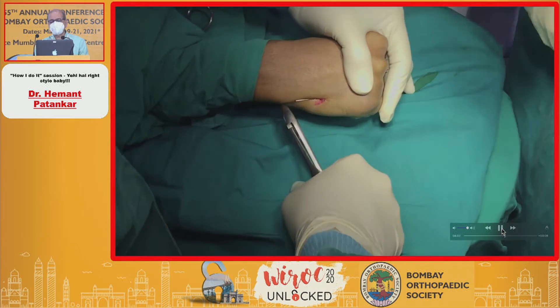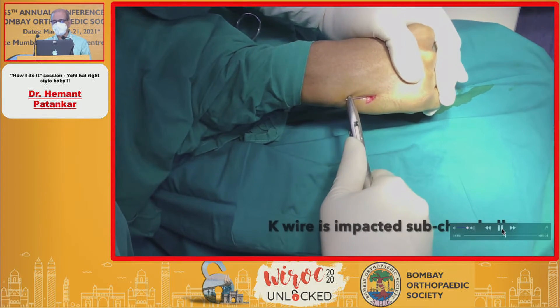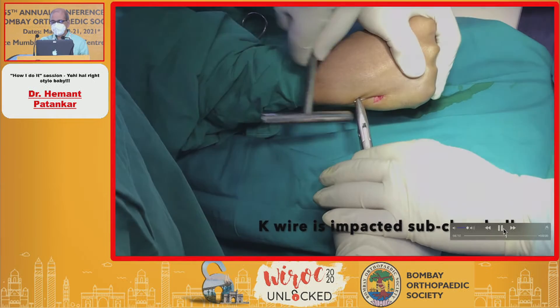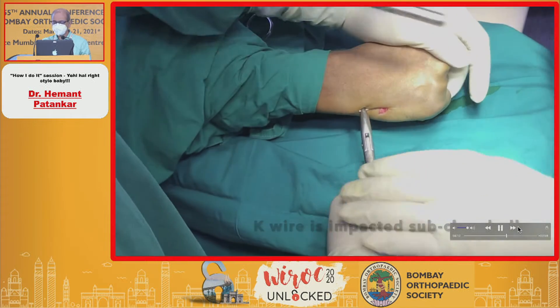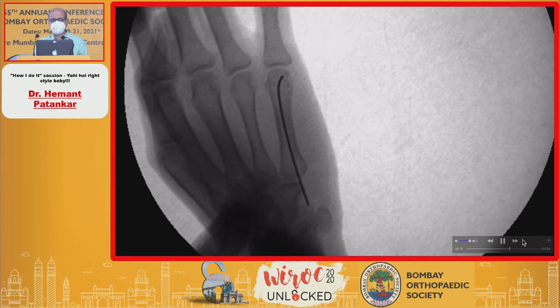That is the wire which is now cut. It is now very less likely to rotate. Further impaction is performed. That is impacted subchondrally.